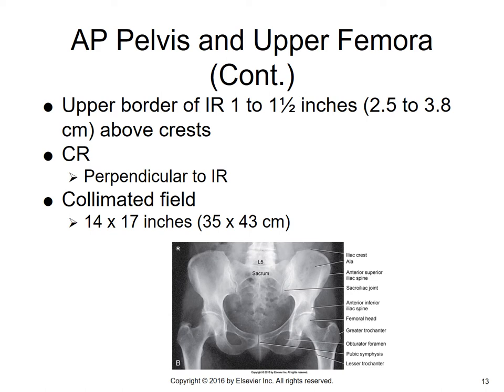If we take a look at the radiograph, we can see — identification-wise — we've got the iliac crest, the ala or wing of the ilium, ASIS, the SI joint, the AIIS, the femoral head, the greater trochanter, the obturator foramen, pubic symphysis, and the lesser trochanter.